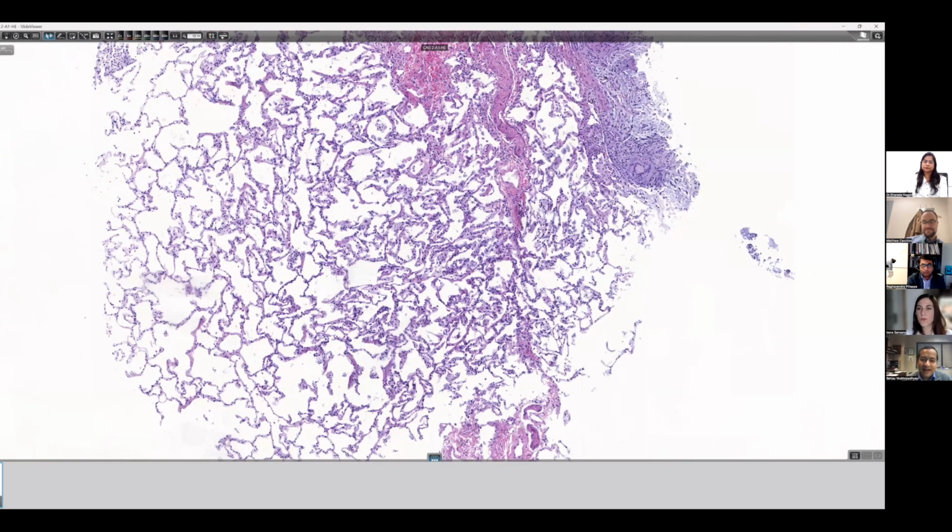Yes. I think that idea comes from Robbins or somewhere, that naked granuloma idea in sarcoid, that sarcoid only has to be granuloma and there should be no inflammation. That's not correct. You get so much inflammation next to the granuloma in sarcoidosis in some cases, lots of lymphocytes and all that, but it's the lung away from the granuloma that has to be normal, and it is almost always completely normal in sarcoidosis.